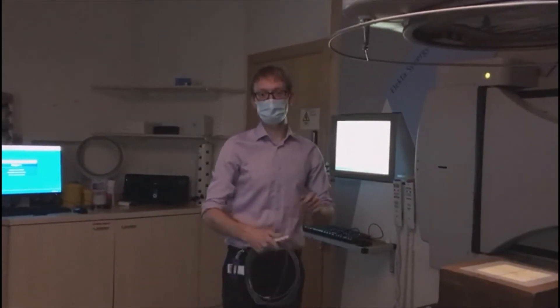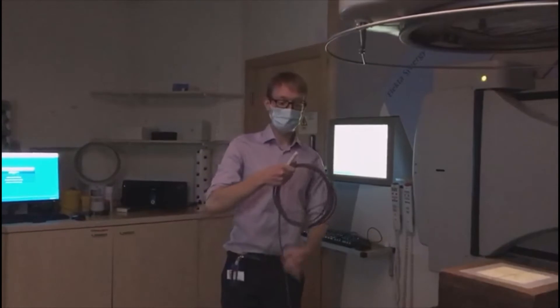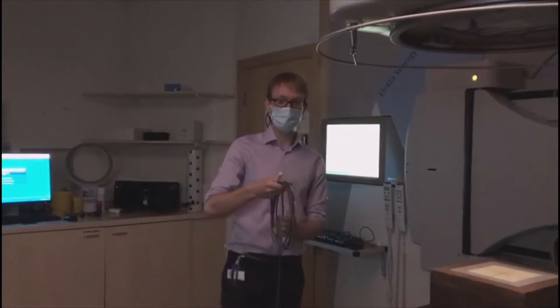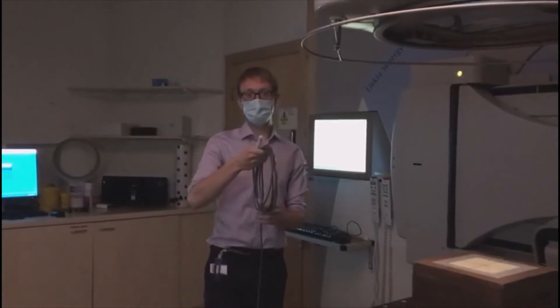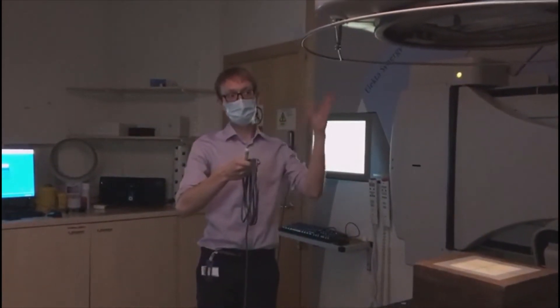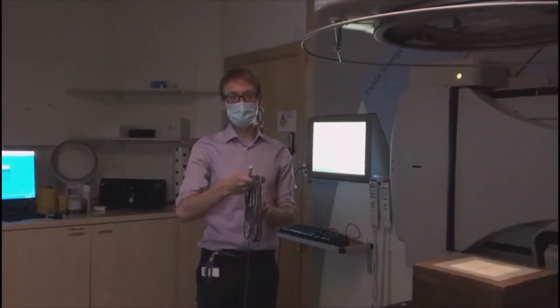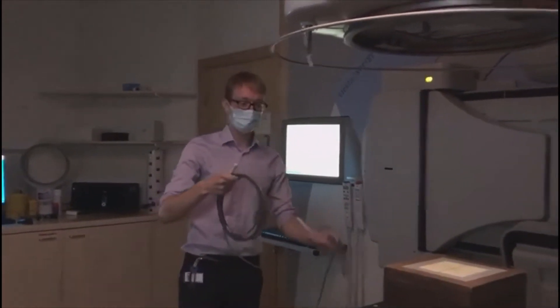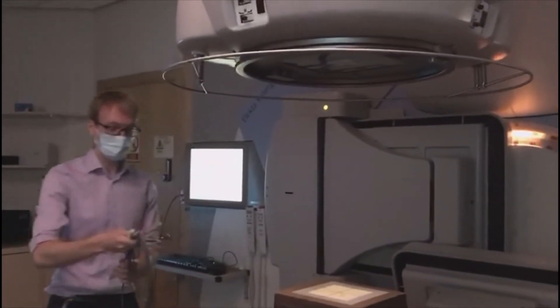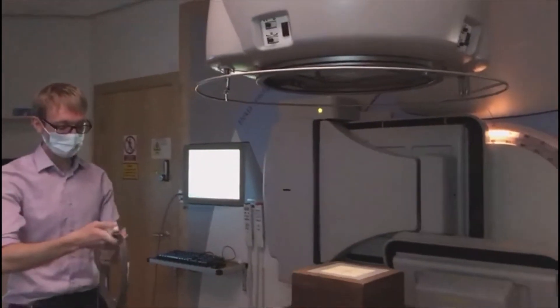Hi, I'm Adam, I'm a clinical scientist. What I've got here is a chamber which is used to measure the amount of radiation coming out of this machine.